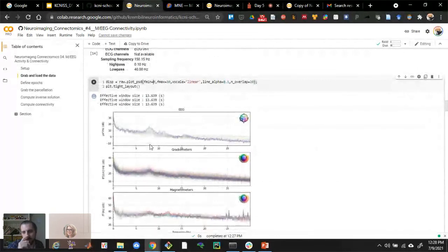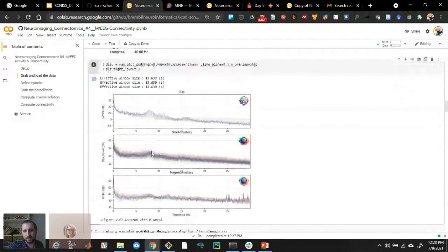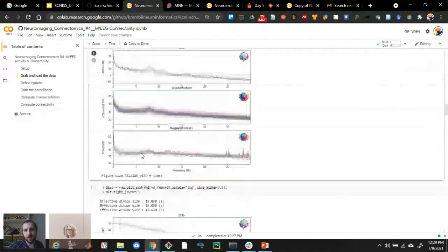Now this points to something. Other people's peak frequencies will typically be more in the 8 to 12 hertz range. But certainly, those boundaries, like the border between low alpha and high theta, you shouldn't think of it as a categorical difference. It's something that is clear in the data, like a principal oscillatory peak across multiple sensors. It's the same thing as if someone else has it 2 hertz higher. It's not a different thing.